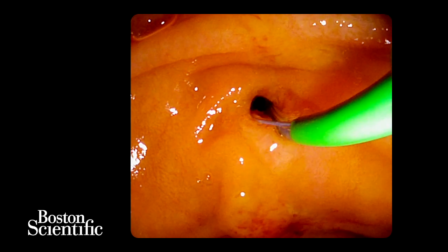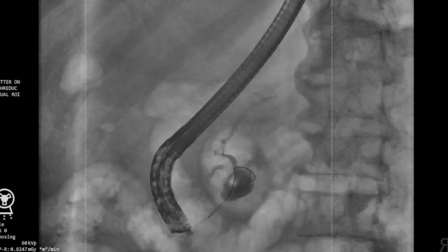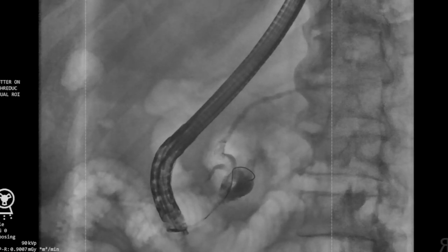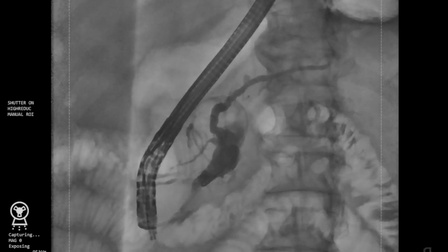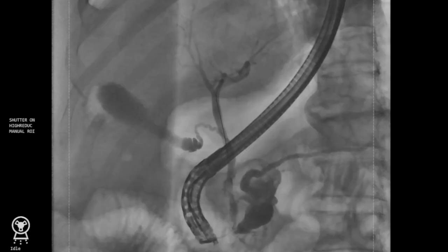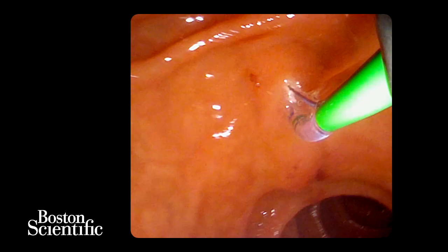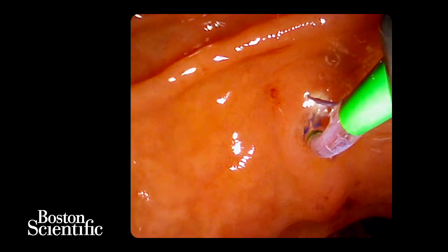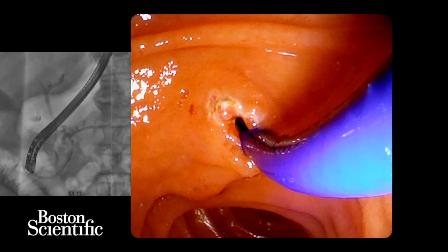Given the patient's underlying comorbidities, a tissue diagnosis was desired, and therefore an ERCP with pancreatoscopy was undertaken. The main pancreatic duct was cannulated and after performing a sphincterotomy, the pancreatoscope was advanced into the cyst. Papillary projections were seen within the cyst component.